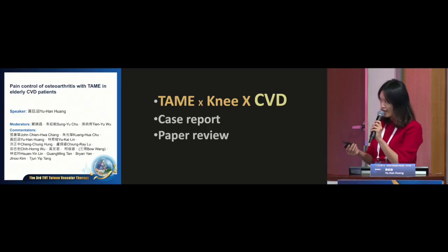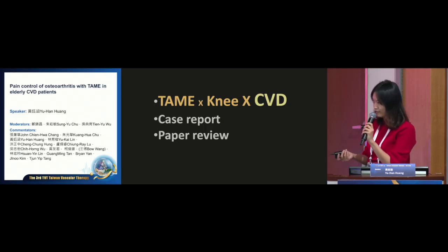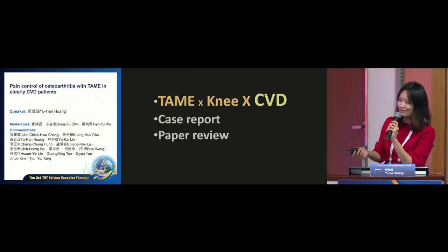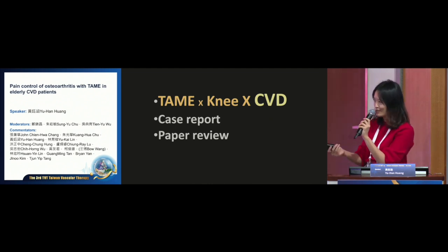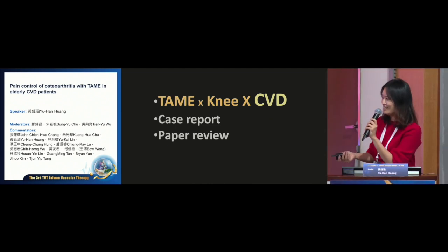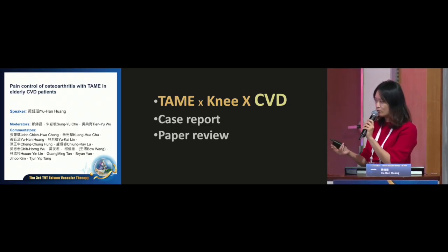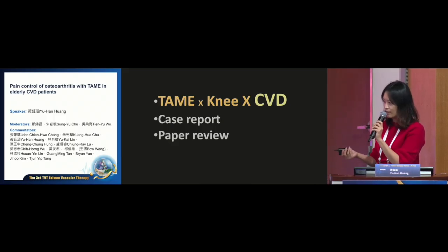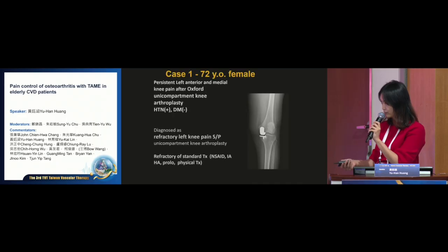So I will focus on these CVD patients. Everyone can be assured that the patients were all referred to me by Dr. Wu Dianyu, so they are all CVD patients. I will present 2 cases, show the CTA of the lower limb and lower limb vessels, and review the papers.